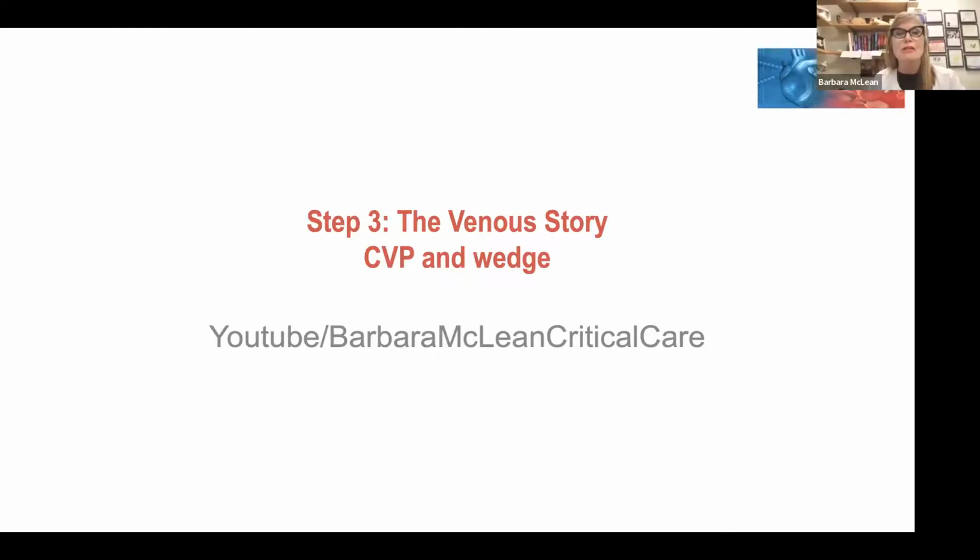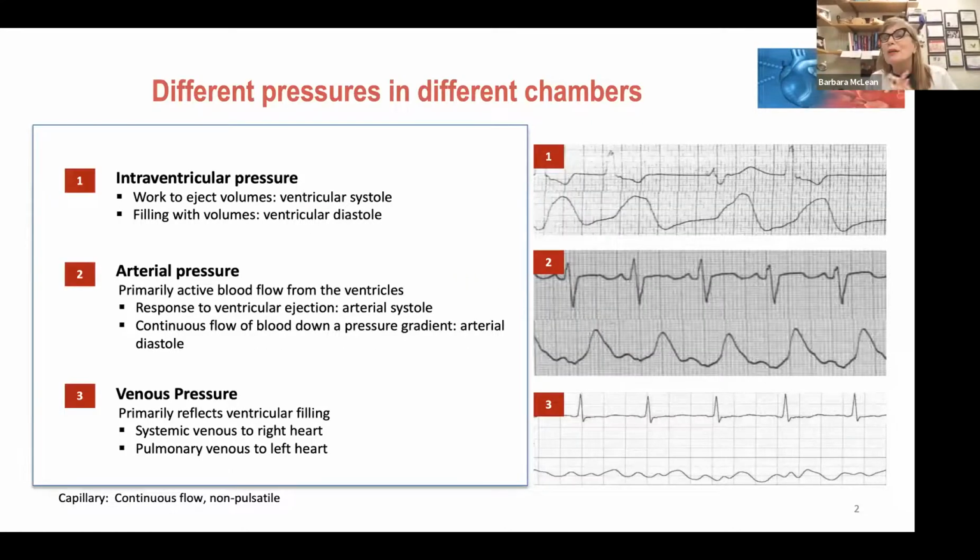All right, my friends. It is really phenomenally important to remember that when we're talking about vascular monitoring, meaning monitoring a chamber that has blood in it, there are 3 basic types. First of all, the venous pressure, which is our most common. We're looking at systemic venous return to the right heart.